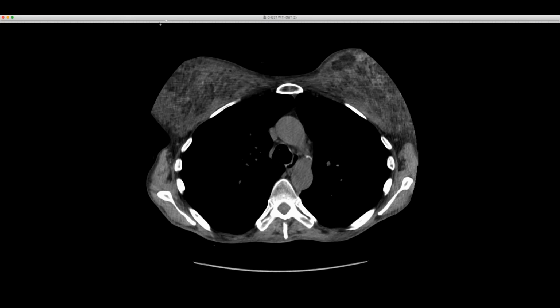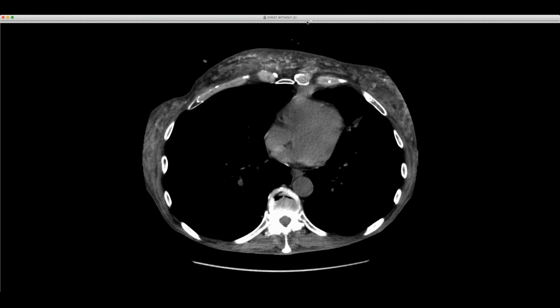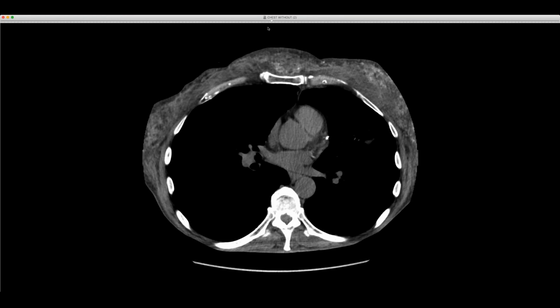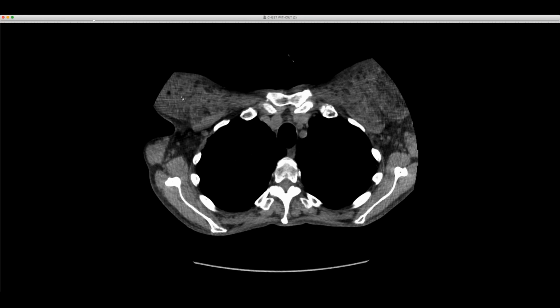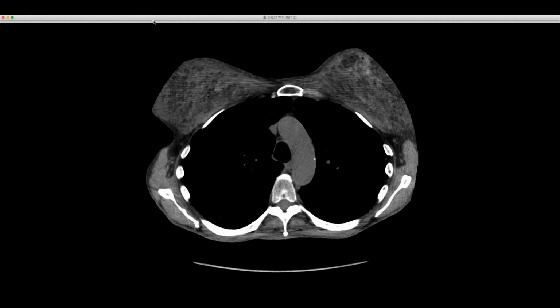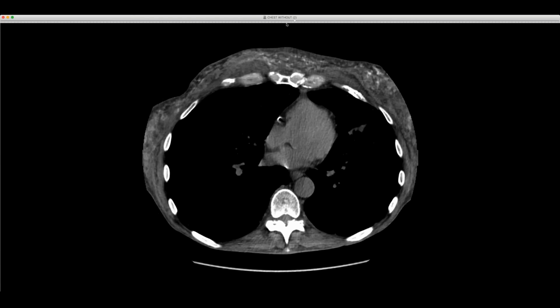However, this patient also came in with a very high hypercalcemia. So when I saw this, I thought, well, this is a granulomatous hypercalcemia, which this is thought to be. It's unclear whether this patient is actually injecting free silicone, or there's some indication that maybe some of this is mineral oil on top of that, and I'm not sure. You see these very lucent globules. So I'm going to get more history on that, but presumably this is some sort of reconstructive injection causing a granulomatous reaction with a hypercalcemia related to that. So I just thought that was a really fantastic case.